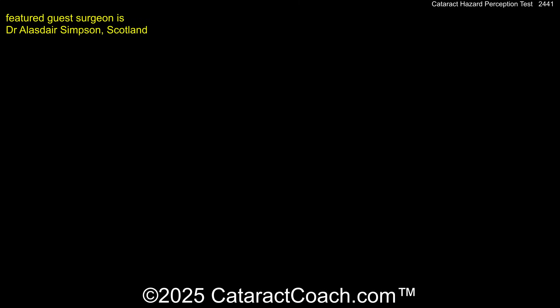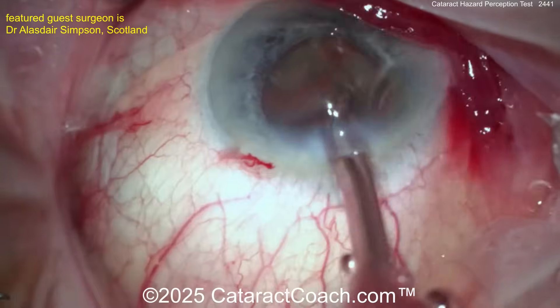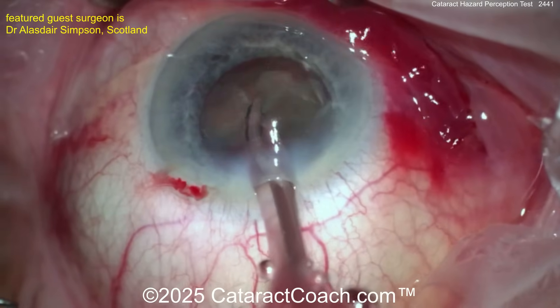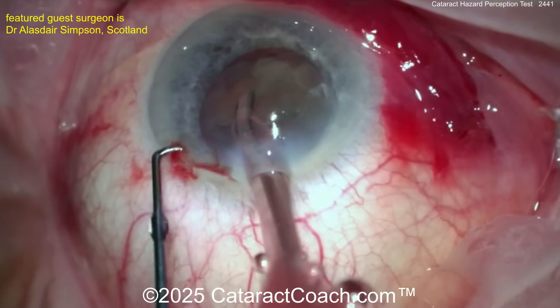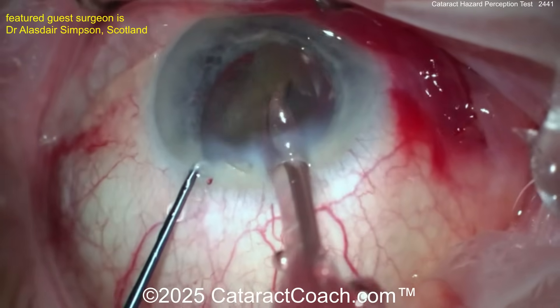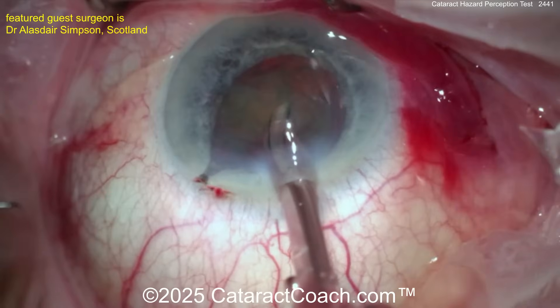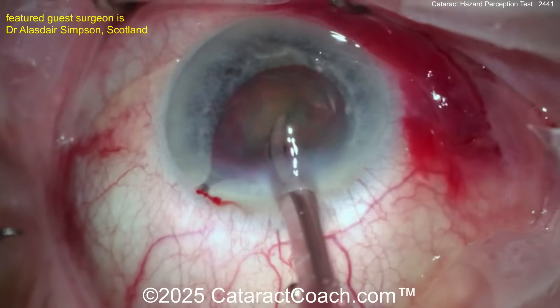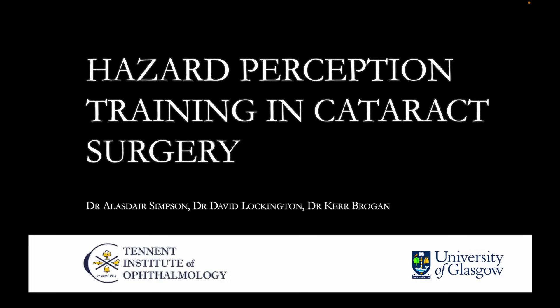Here's our last clip — can you get this right? Phaco probe in, taking this out. I wish the eye was in primary — see the corneal light reflex over the temporal incision? That should be at the center of the cornea; not ideal. Put your hand down — look, the iris is coming out of the incision! You've got to get better positioning here. I don't know why you like operating superiorly.